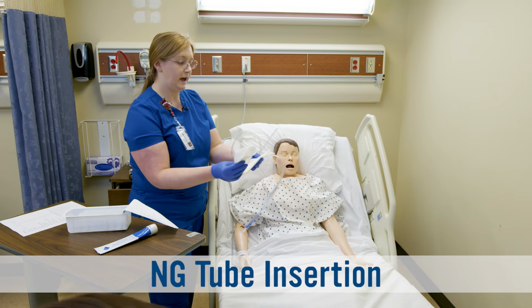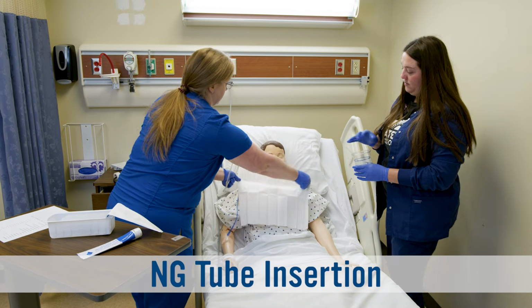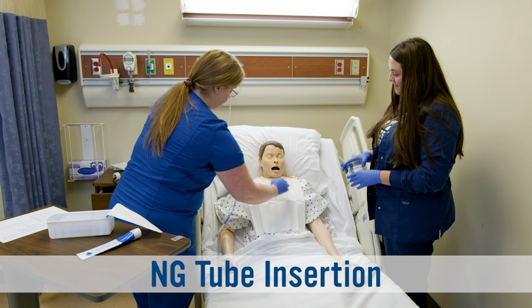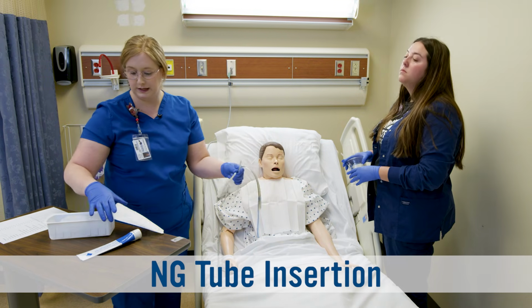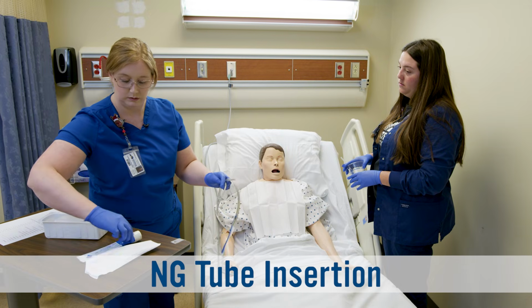All right, so I'm going to go ahead and put this towel on my patient. I have my assistant here to help me with the cup. I'm going to go ahead and lubricate my tube.